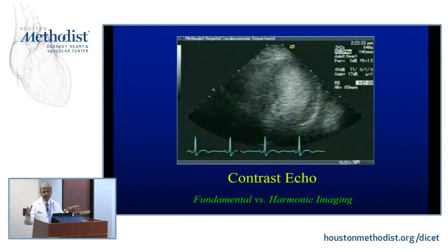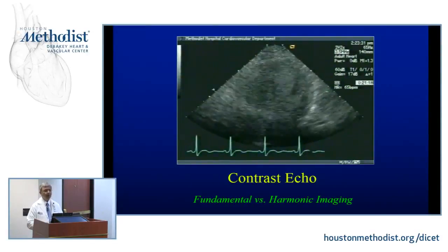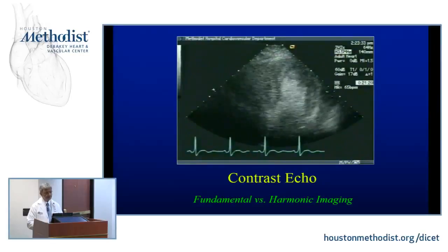Now for sonographers and physicians, if you use contrast nowadays, there's a preset for contrast, and it turns on your harmonic. But if you're a novice and you have a brand new machine that has not been customized, with no presets or anything else, you need to know this so at least you can do a good job. So that's the importance of harmonic. So we learned two things.